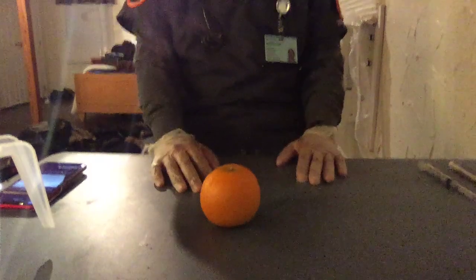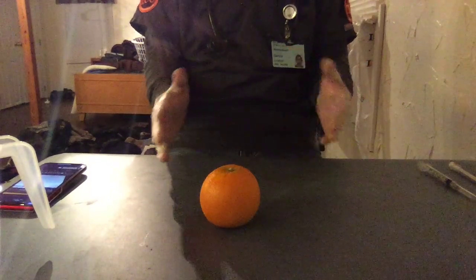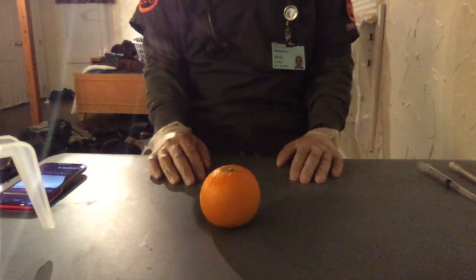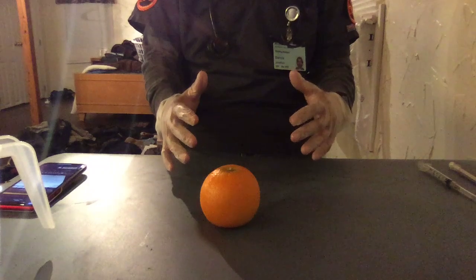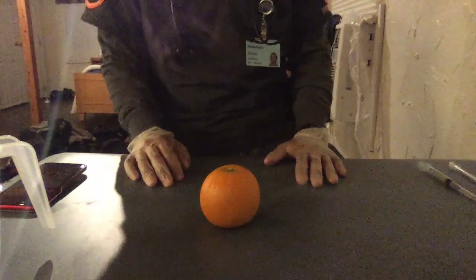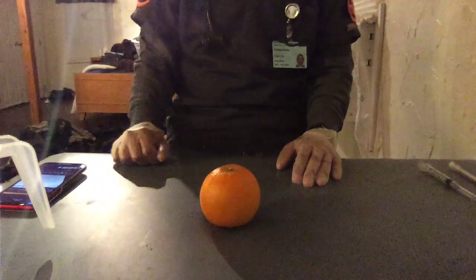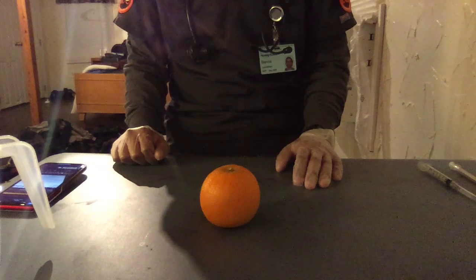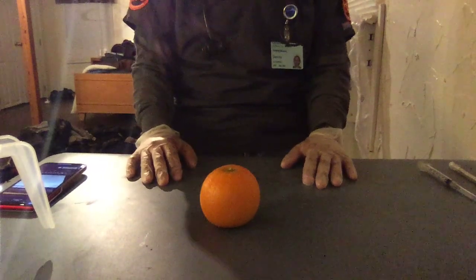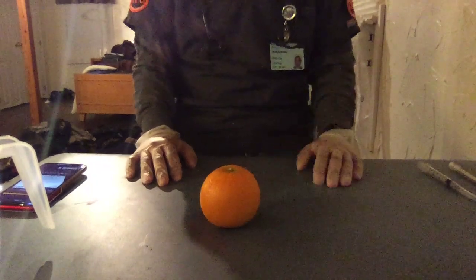So again, I will check my medication twice before going into the room, and then the third time in the room, it will be with the patient. So I gather all my supplies, and then I come into the room, and then I verify with the patient twice. So I ask her name, Sally Smith, and then her date of birth, 6/8/55. She gives it to me. So I verify that it's the right patient. So now we'll do my last check for my medication.